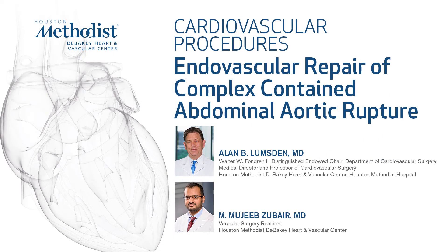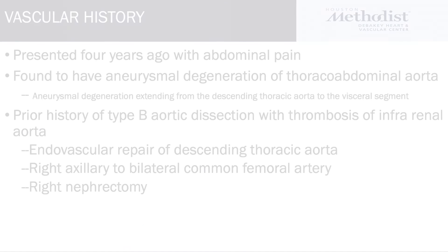This video demonstrates endovascular repair of a contained rupture that resulted from suture line dehiscence of an aortobiiliac bypass graft in an 88-year-old female.